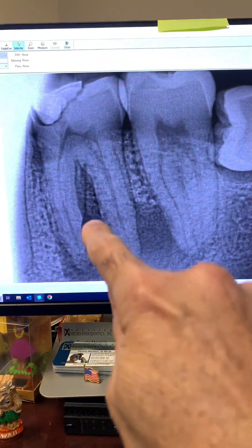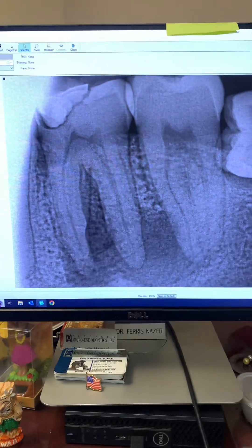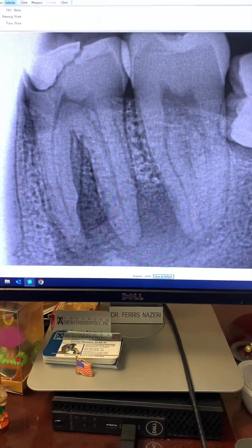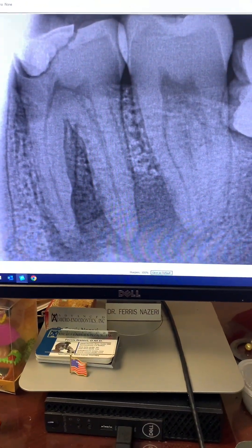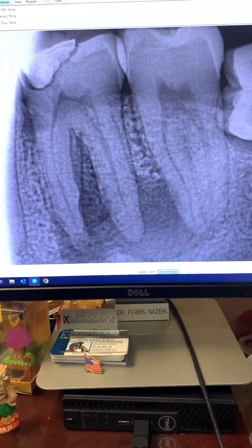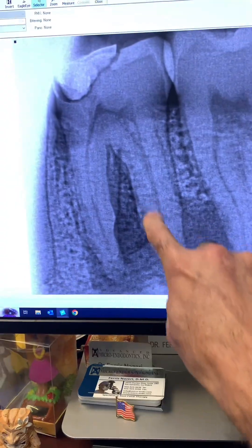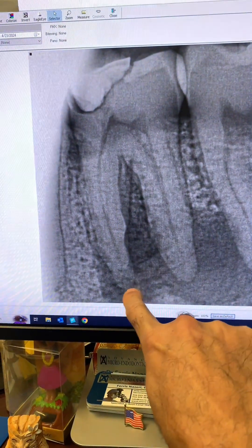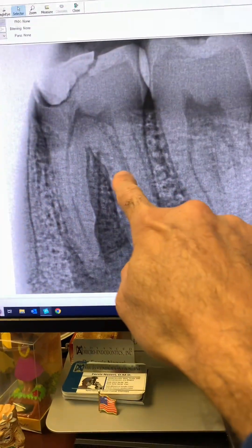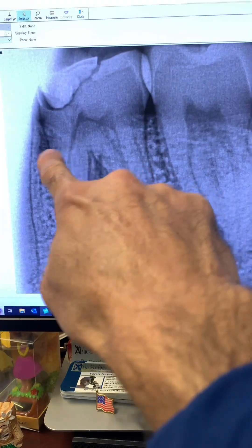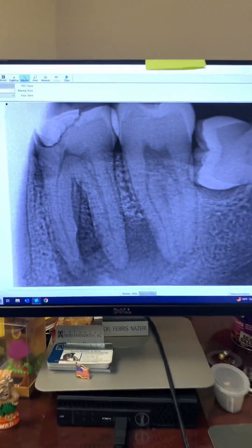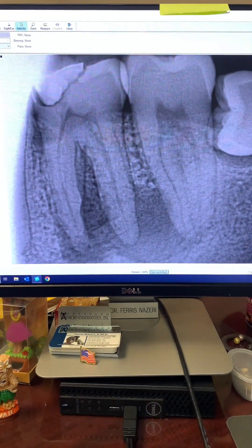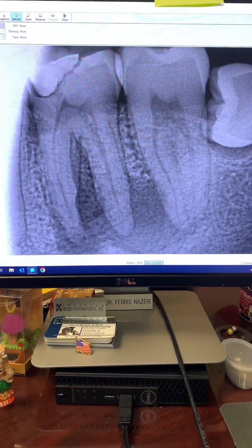You can also see the external root resorption associated with the tooth. All of that resorption — and again, this patient is only 27 years old.